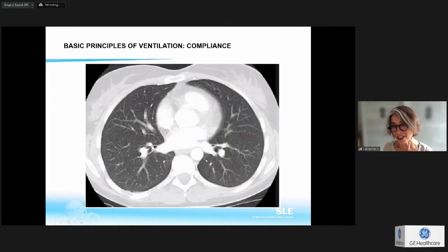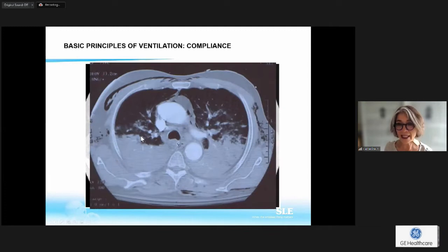My lung was such kind of lung, quite a normal lung. If I push, for example, 10 milliliters in this lung, you will have 5 milliliters each side, and you will see that each alveoli will receive a little bit of tidal volume. Okay. When my compliance is lower, it might be something like that.